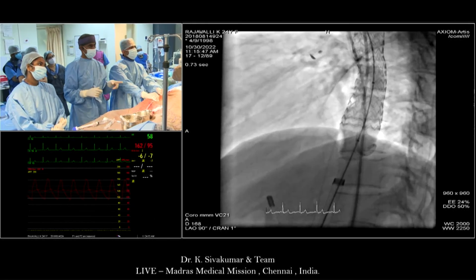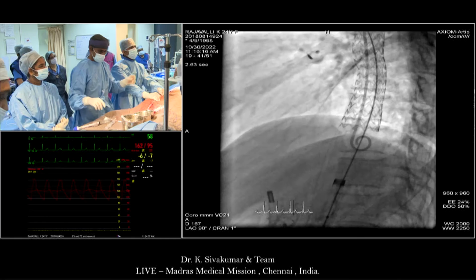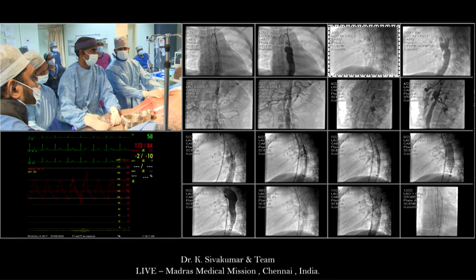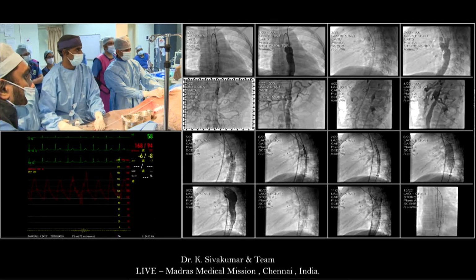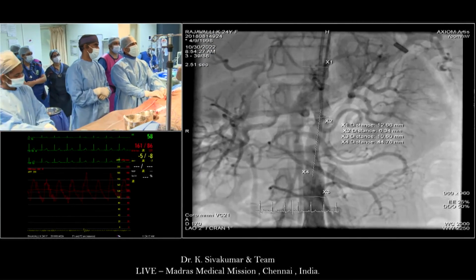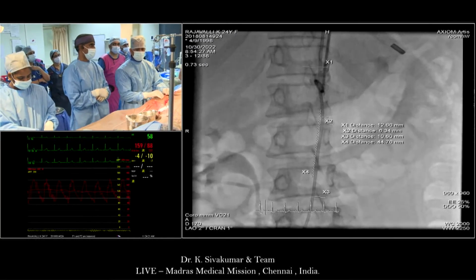Now we are going for the abdominal aorta. Once again, show the abdominal aortic pictures. If I may comment shortly. Before this procedure, we were chasing the artery of Adamkiewicz, and it's perfectly visible in your injection. Where is it? It's exactly where we found it.